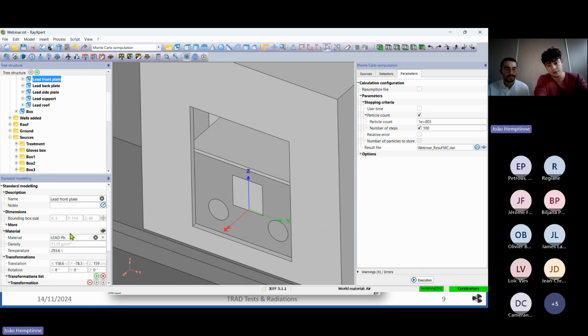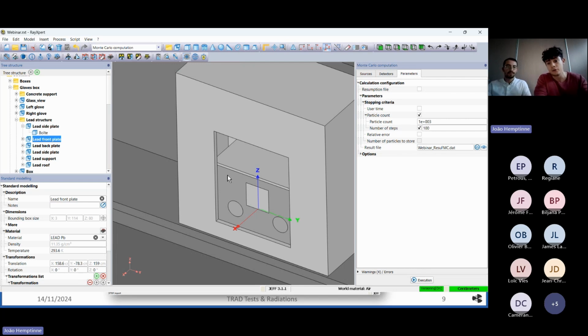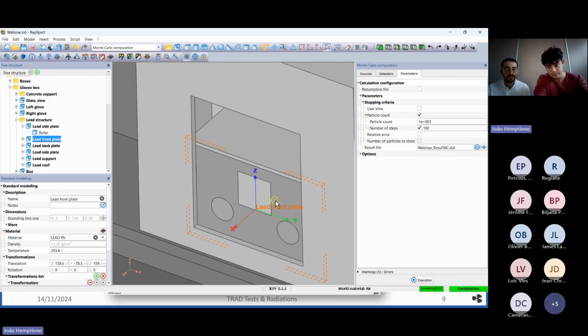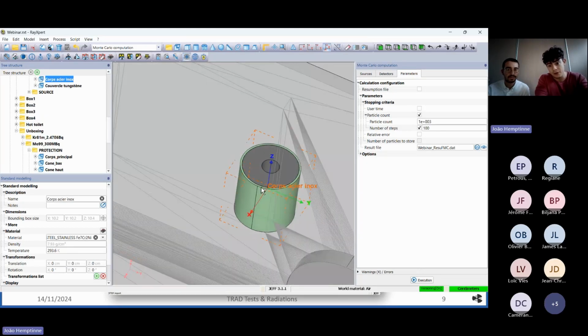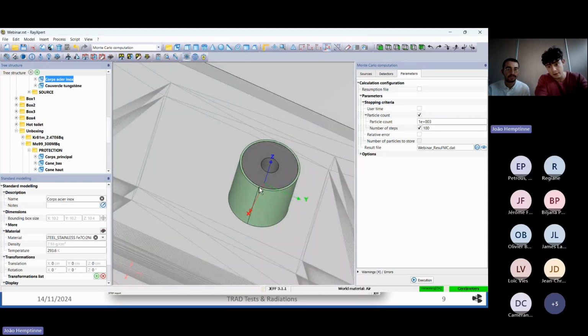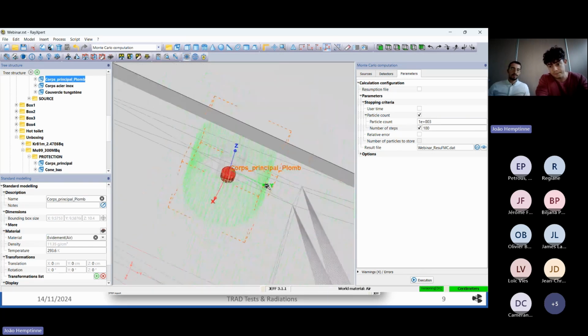all the information about the materials. And in the tree structure, you have access to all the basic shapes with which I was able to model all this. So here you got the gloving box with glass and lead, and inside this glove box, here you got a radioactive source inside the shielding. You will be able to see the source right there.